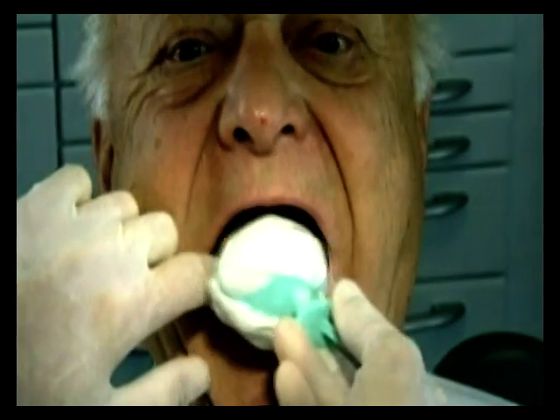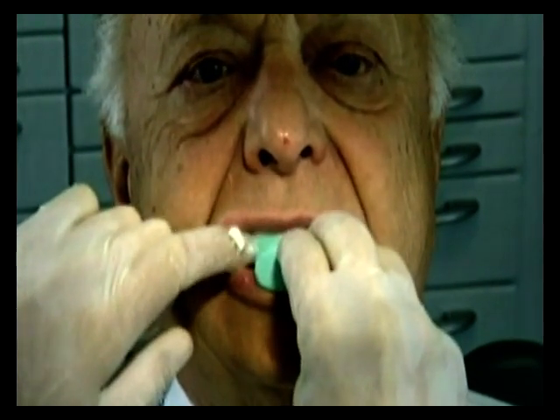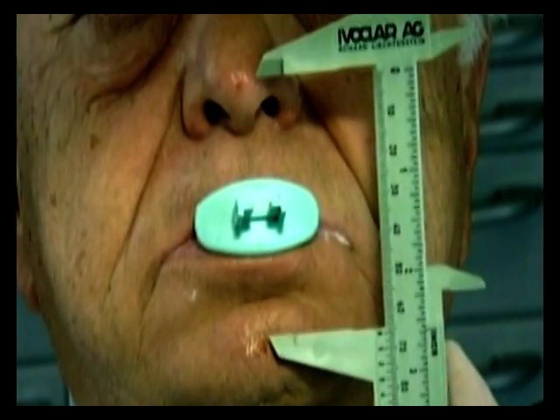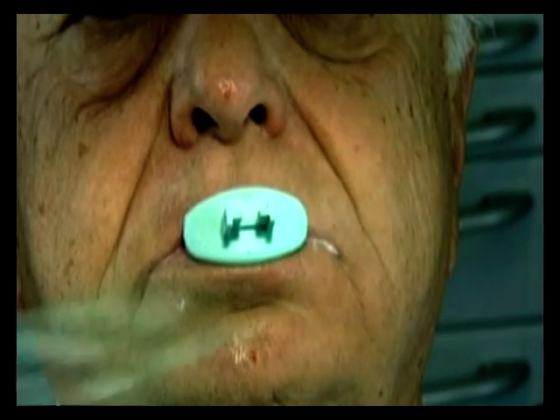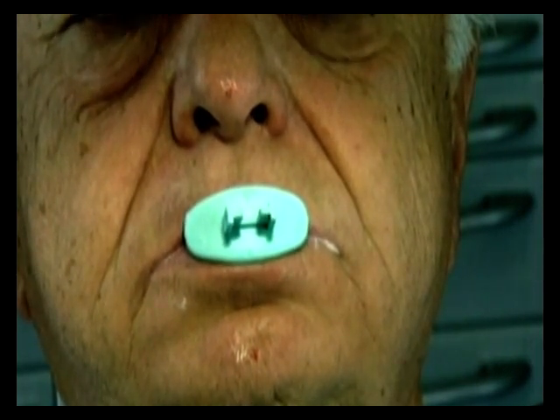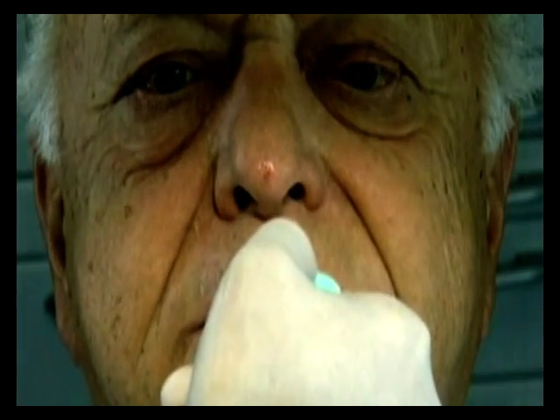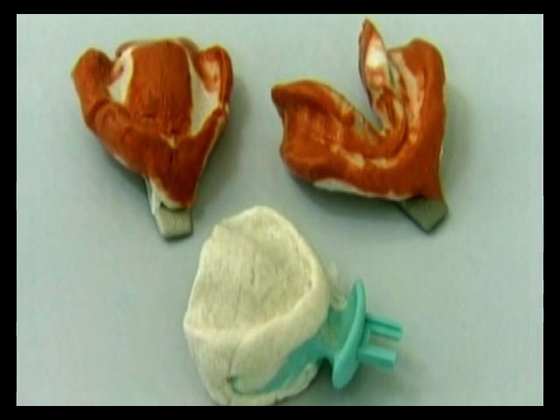Mix impression material and load both halves of the centric tray. Insert the centric tray sideways into the oral cavity. Advise the patient to close the mouth slowly until the marked occlusal height is reached. The mandibular and maxillary impressions are sent to the dental laboratory together with the centric tray.